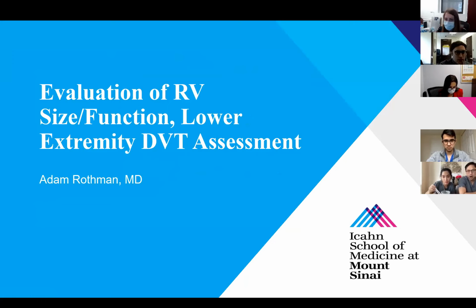Basically the point for today is, I think the last time we focused mainly on left ventricular function. So today I wanted to switch gears a little bit and talk more about right ventricle size and function, and then also talk about lower extremity DVTs, because I think both of those go hand in hand and are probably underutilized or underassessed at the bedside, but something that can be done very quickly.